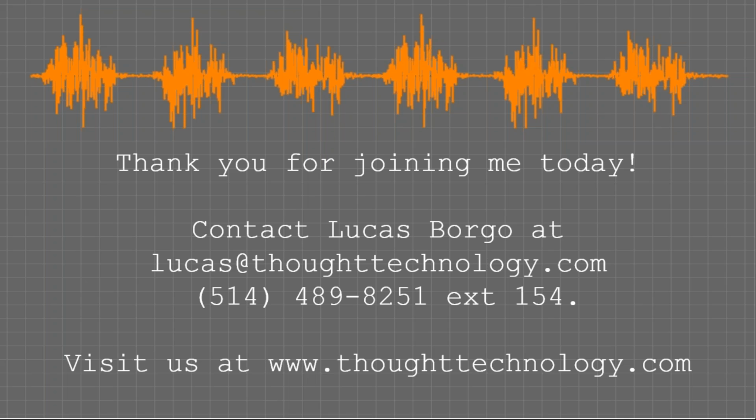And then Bob, let's touch base back channel and talk about what it would take to do that for you with the MyoScan Pros. We'll take a look at what system you have, and we'll go from there.